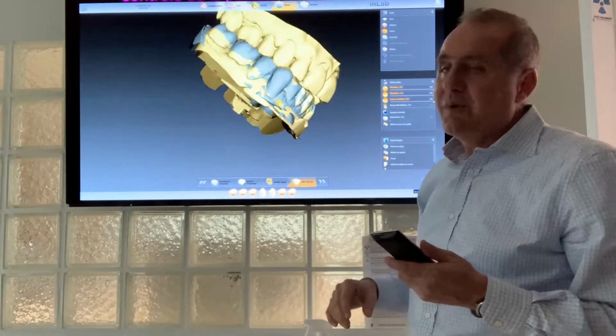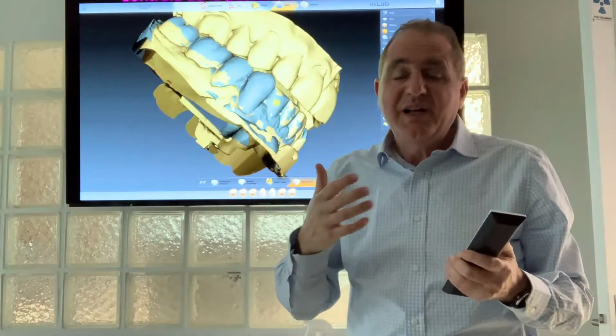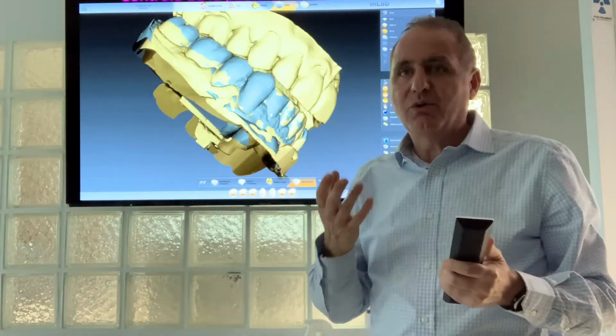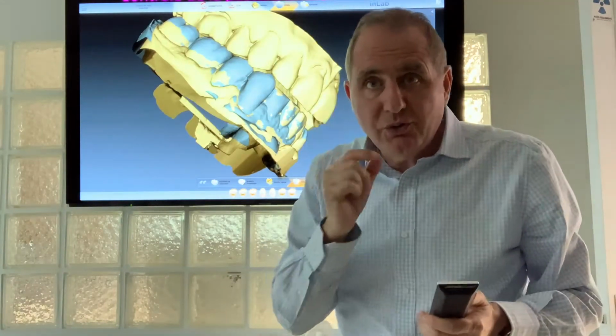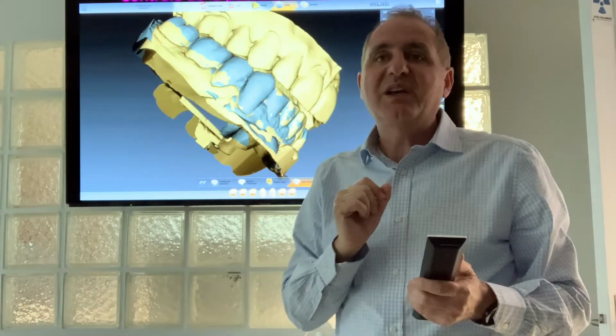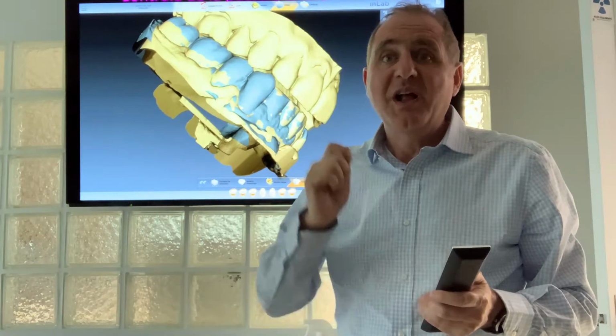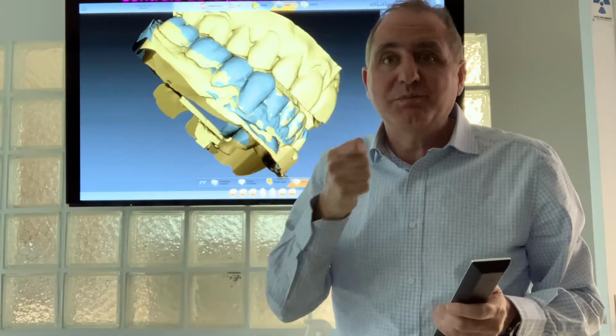Okay, so this is the way I work, to compare and to see exactly if the posture of the mandible is okay or not. And it's not you who get this, it's only the patient who gives you this by swallowing on this wax. So it's very physiological and at the same time reproducible.